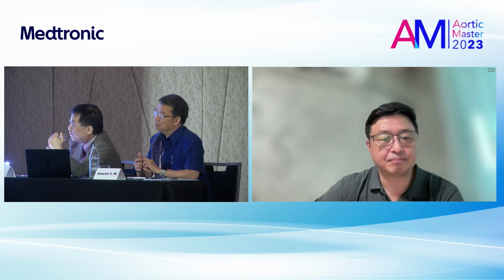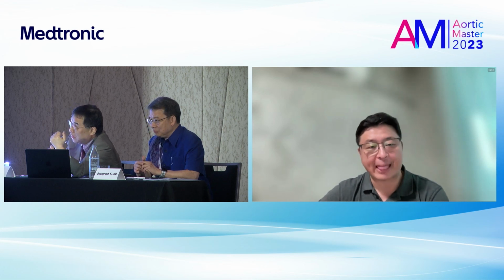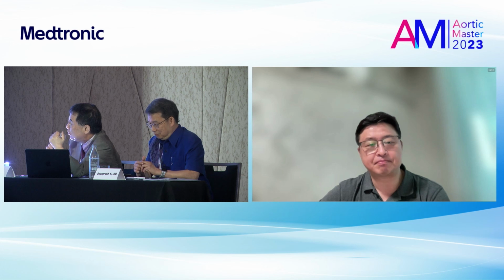All right. I would like to add something to Dr. Morikage's paper. He is now trying to do prophylactic IMA and also lumbar artery embolization. And in my hospital also, we are now trying to do complete embolization of the branches arising from the aneurysmal sac. It is a very difficult issue that should be elucidated, as Dr. Boon presented on long-term durability of EVAR before your presentation. But we have to continue to discuss this.